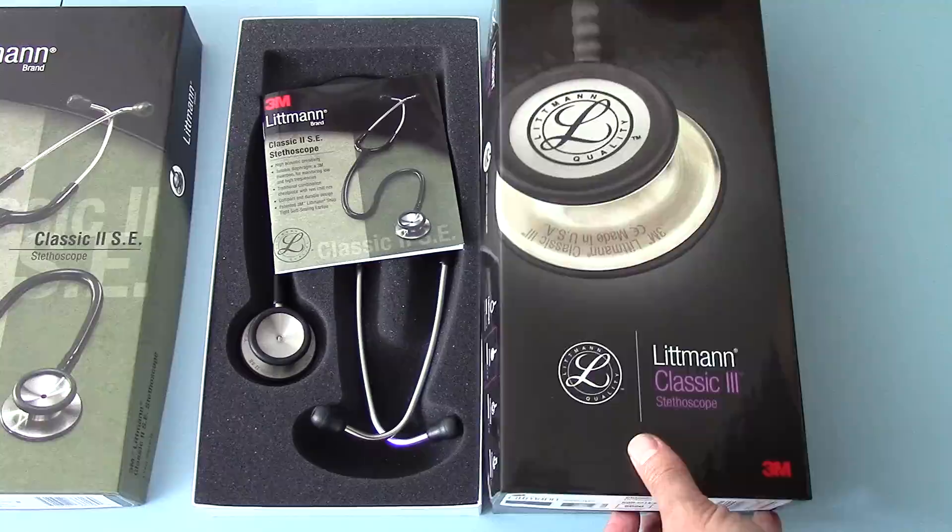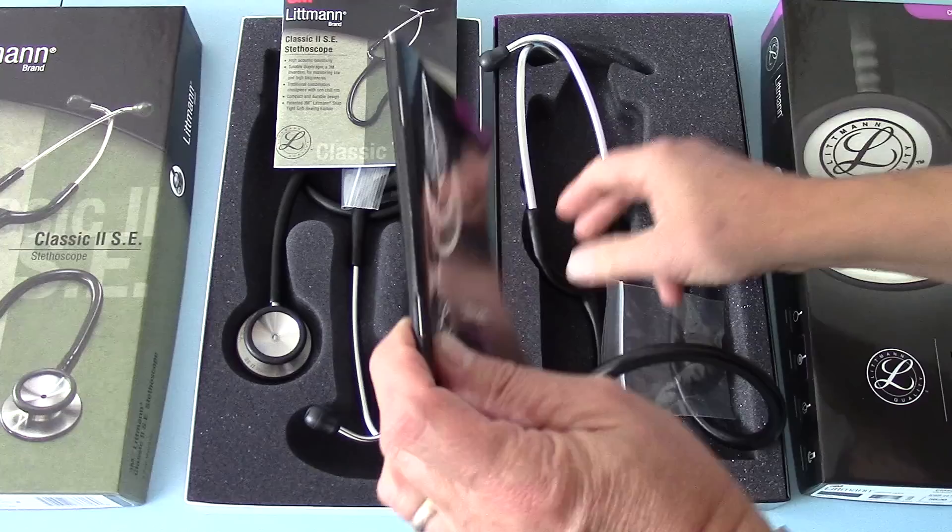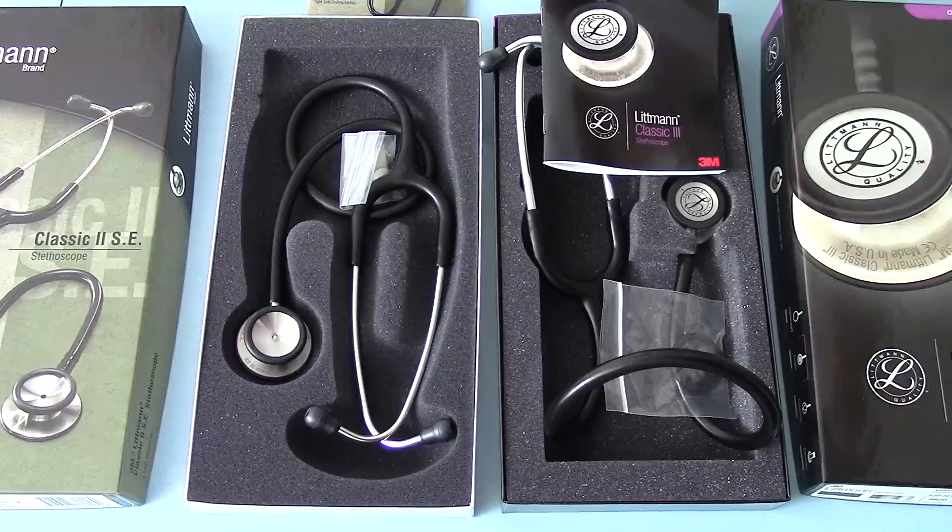The Classic II SE is on the left and the Classic III is on the right. Both come with a set of Lippmann brand instructions for use and guidance, which is nicely written.